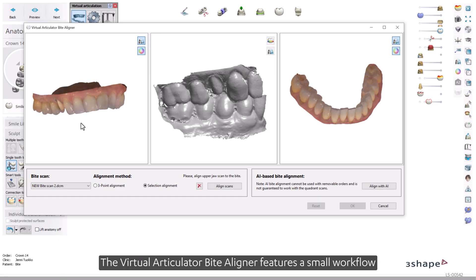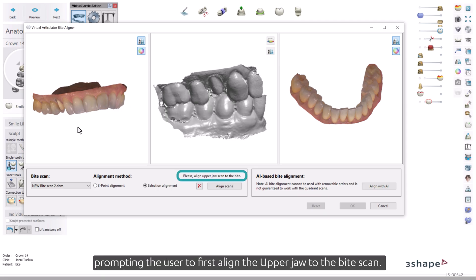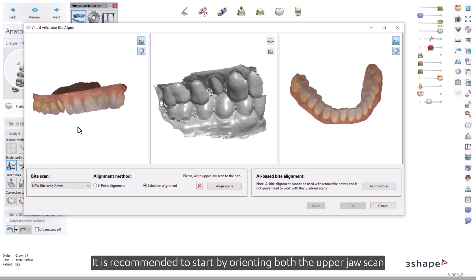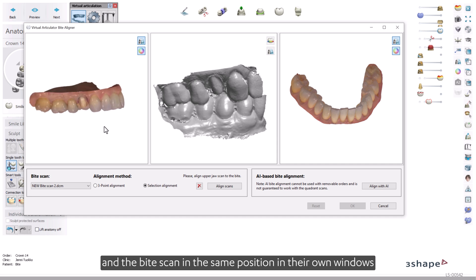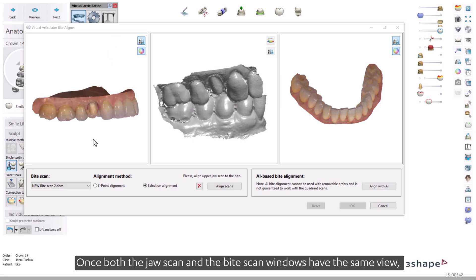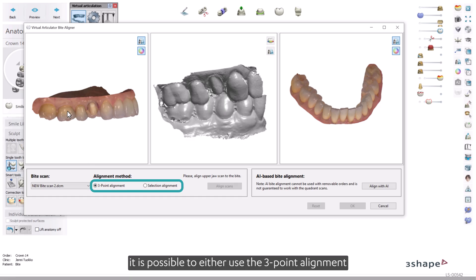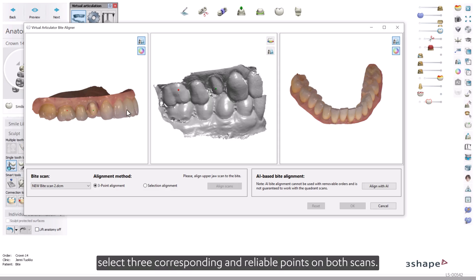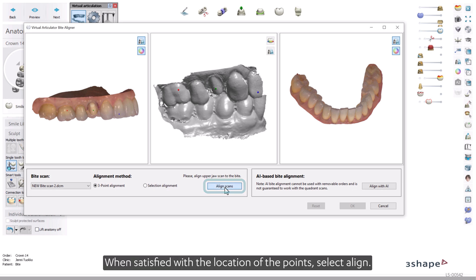The Virtual Articulator Bite Aligner features a small workflow prompting the user to first align the upper jaw to the bite scan. It is recommended to start by orienting both the upper jaw scan and the bite scan in the same position in their own windows for easier identification of areas critical for correct alignment. Once both the jaw scan and the bite scan windows have the same view, it is possible to either use the three-point alignment or selection alignment tool. When using three-point alignment, select three corresponding and reliable points on both scans. When satisfied with the location of the points, select Align.